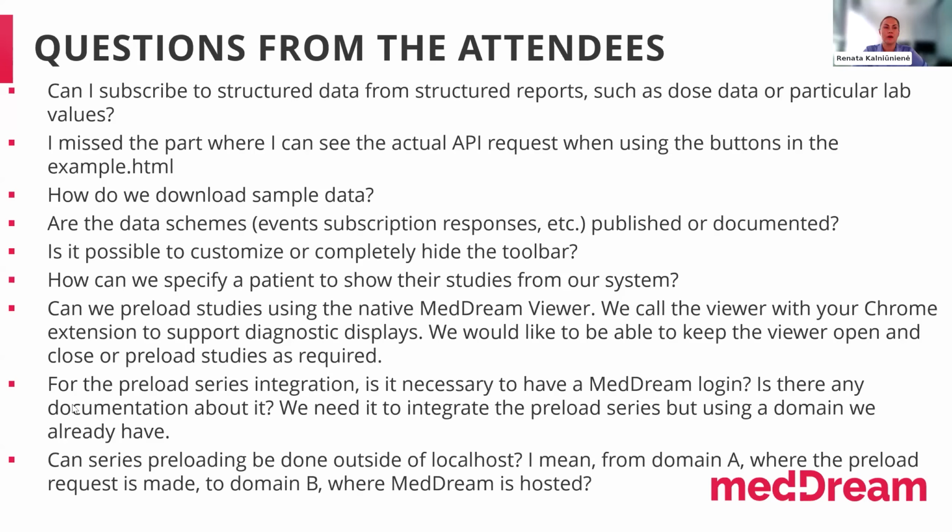Okay, I'm reading the next one. For the preload series integration, is it necessary to have a MedDream login? And also another attendee added to this one. Is there any documentation about it? We need it to integrate the preload series, but using our domain we already have.